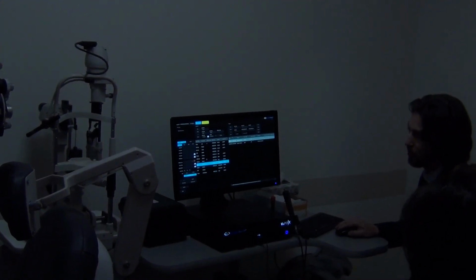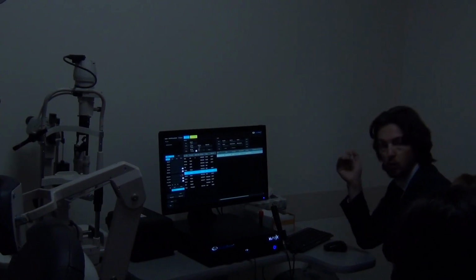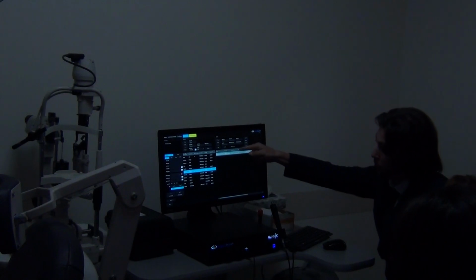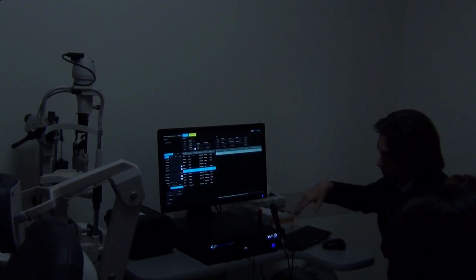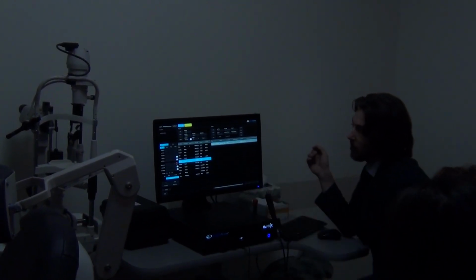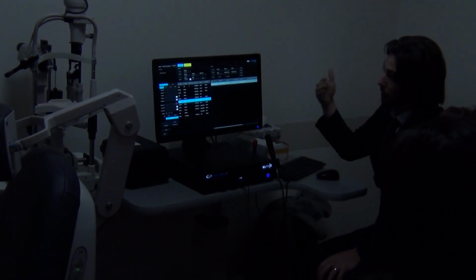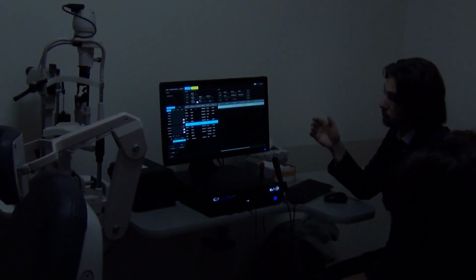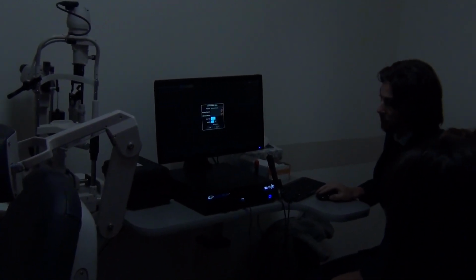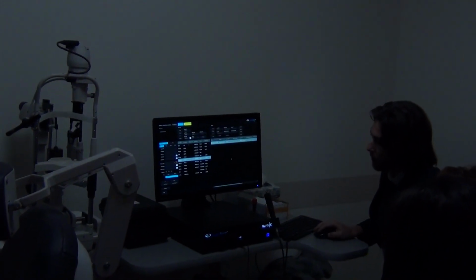You can choose any patient on a list. On the right side of the screen, you will see the type of exams which were performed. Again, depending on B scan or UBM, you will see a list of them. So if a patient comes back again, you just find this patient through the main search, and all you need to do is click on new, and the unit will create a new exam. Like I'll show you an example, right? New exam, and you choose B or UBM, B goes as a default, right eye, left eye, or both eyes, so it doesn't matter.